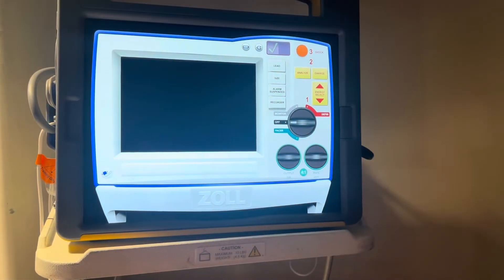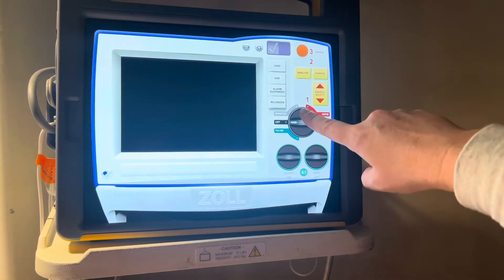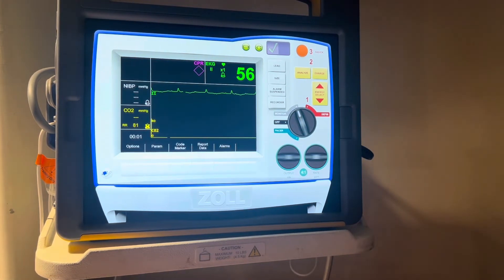Now it's time to turn on your defibrillator. Now that your defibrillator has arrived and your quick combo pads are on, it's time to turn the defibrillator on. With this Zoll, you'll do this by simply turning the dial to monitor. Once that's done, you should see your rhythm appear on the monitor.